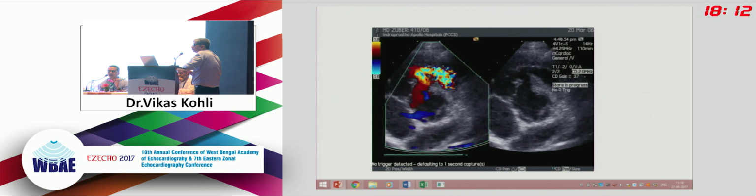So you have to be very careful and mention that it is a malaligned VSD with a deviation of the anterior conal septum. And you have to keep in mind that during follow-up, you check for any appearance of RVOT obstruction. Wonderful. So you think embryologically this is the key reason why the four things always happen together? Exactly, that's one of the theories.